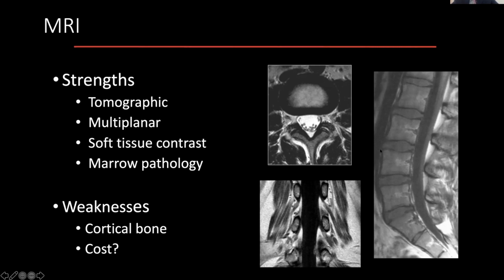And what these relate to are the specific parameters that have been applied in the course of acquiring the MRI. We use what are called radio frequency pulses, which measure energy at times of relaxation of proton spin.